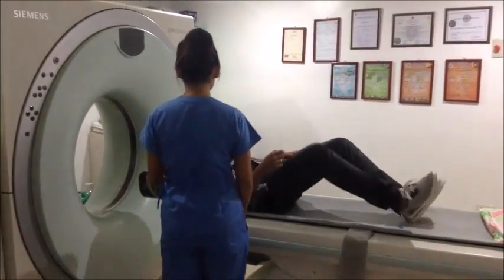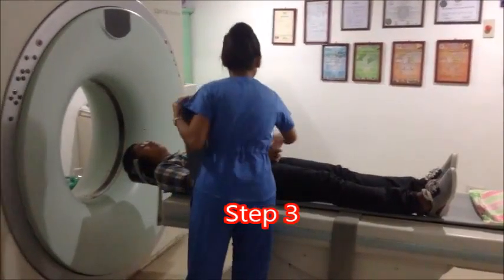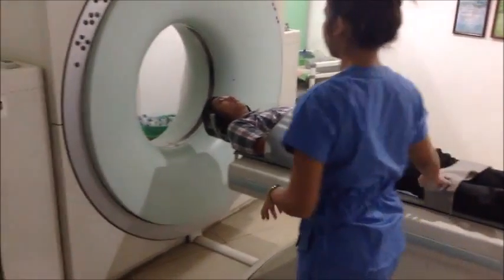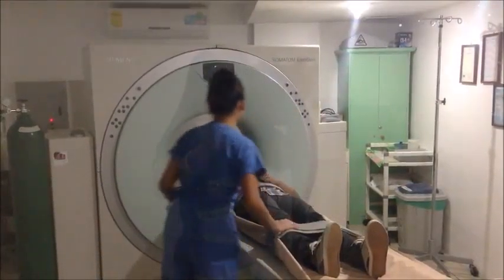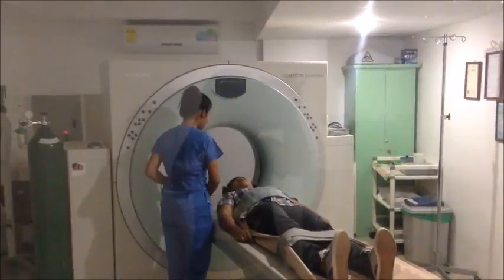The technologist will gently position the patient and secure them on the scan table. The table is slipped into the center of the large donut-shaped machine, which takes the X-ray images around the body. The actual procedure can take from half an hour to an hour and a half. If specific tests, biopsies, or interventions are performed by the radiologist during the CT scanning, additional time and monitoring may be required.